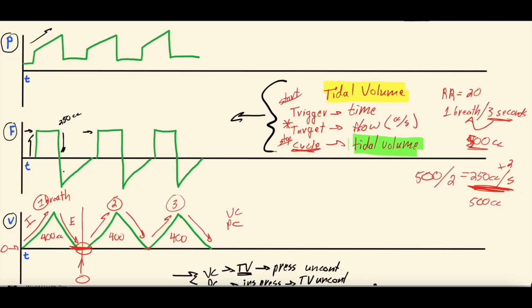This is inspiratory flow. And then this is negative because the patient's starting to expire. So this portion here, the positive portion, is inspiration. This portion here goes all the way down to the negative portion, which is expiration, because this here is 0 flow. Right? So now there's no flow when the breath is done being expired out until they inhale.